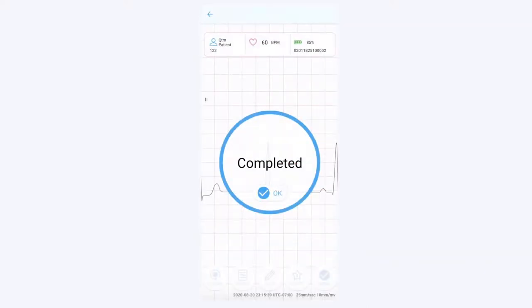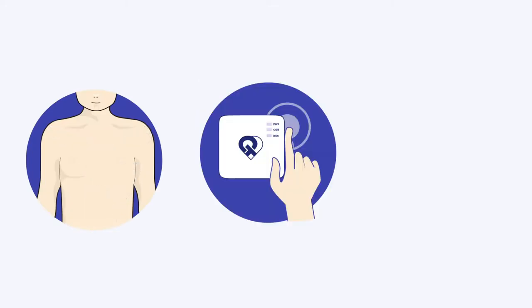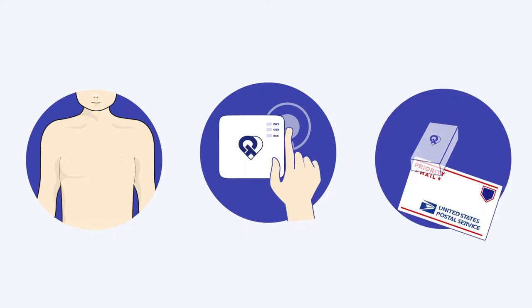After completing three ECG recordings, detach the recorder and remove the electrode. Turn off the recorder, place it in the box, then place the box in the prepaid USPS padded envelope provided. Seal the envelope and place it in your outgoing mail to be picked up, or drop it off at any USPS office or drop-off location.